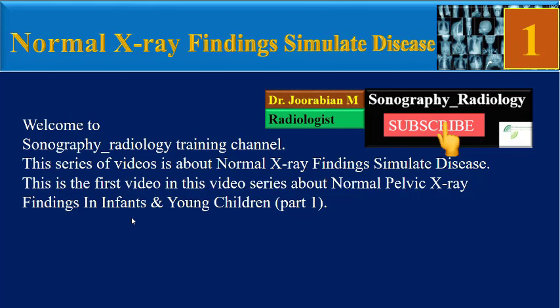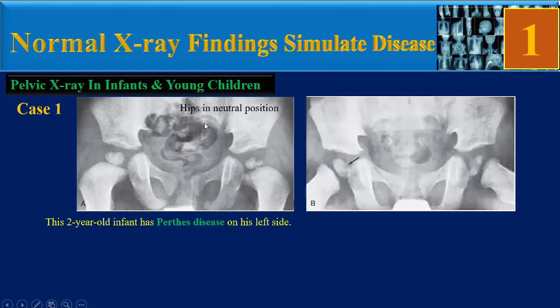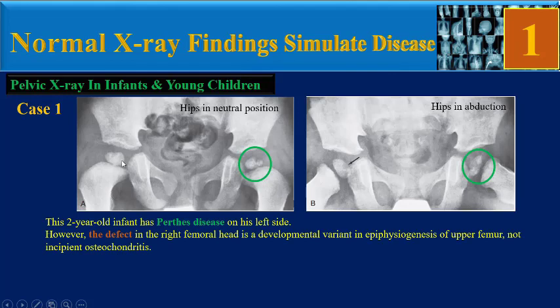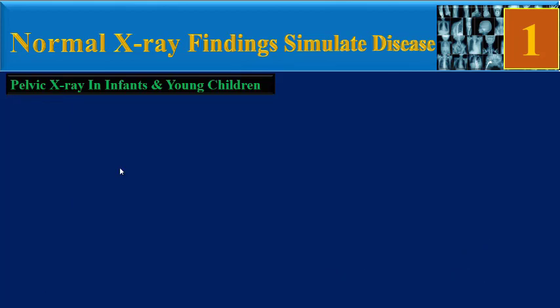We will review 10 cases together. Case 1: a two-year-old infant has obvious Perthes disease on the left side. This X-ray is in neutral position; this is the abduction view. We can see obvious Perthes disease findings on the left side. However, the defect in the right femoral head is a developmental variant in epiphyseal ossification of the upper femoral — not incipient osteochondritis.